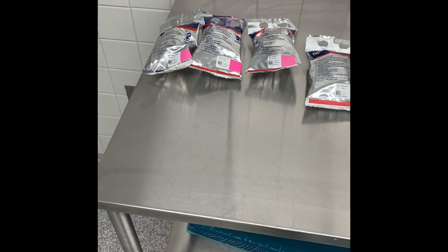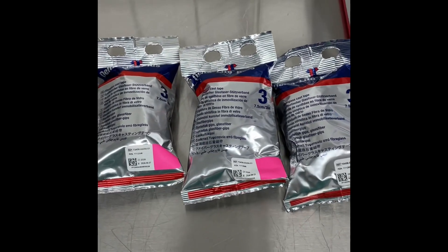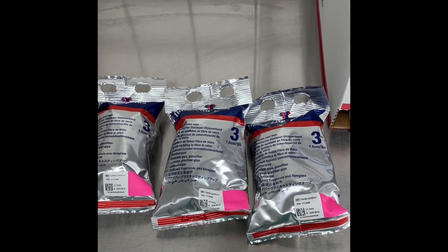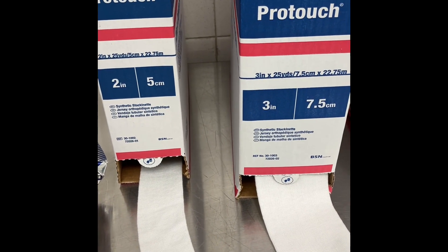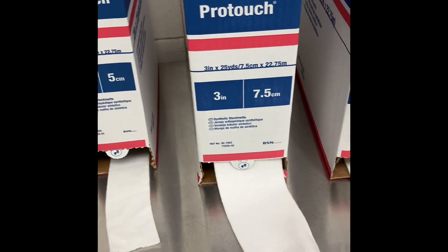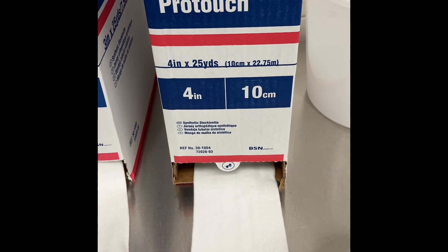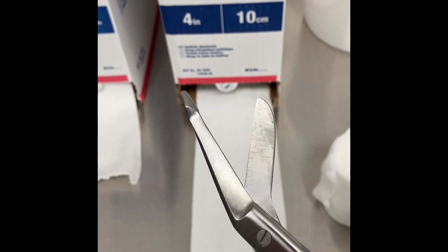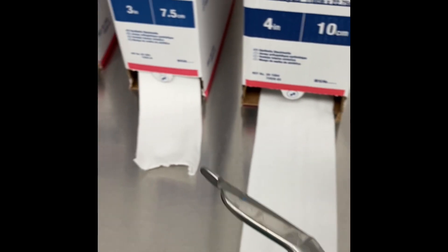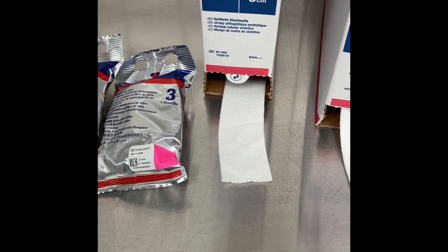Starting with the supplies that I've pulled: I pulled three two-inch cast rolls and three three-inch cast rolls. I'm not sure how large the child's leg is, so I got two different sizes of stockinette — two-inch and three-inch — which will go over the leg before we start wrapping it. I also pulled a four-inch stockinette, which will go around the child's waist. I got scissors to cut all that with — you want to grab a crappy pair of scissors. If you use nice ones out of a tray, it will permanently ruin them, because when you cut casting material, the sticky part will stick to the scissors and they'll be permanently sticky.